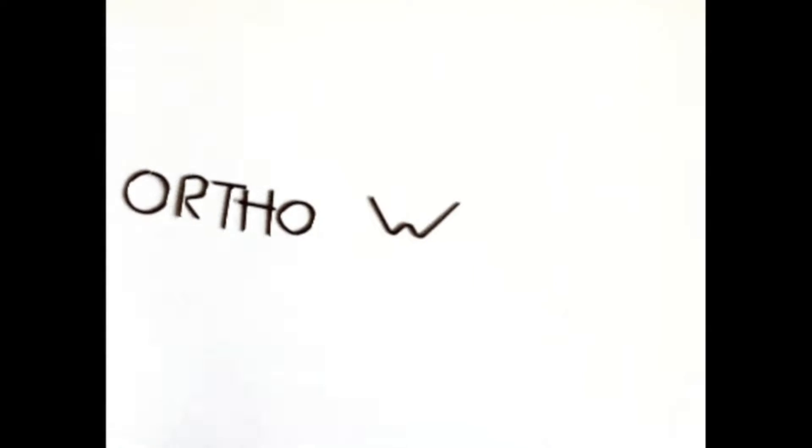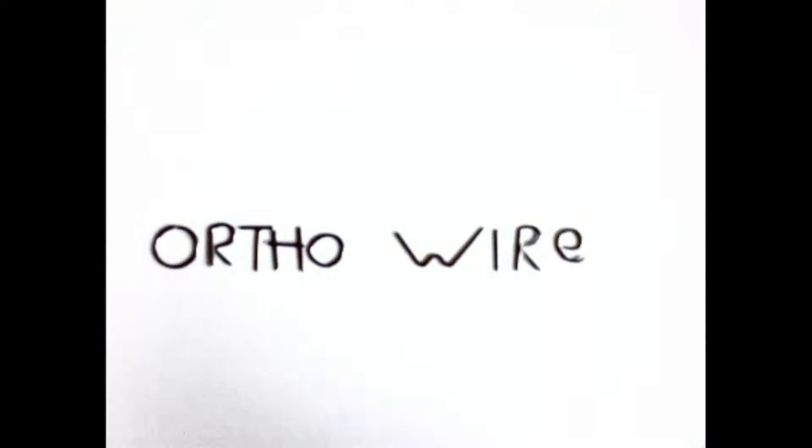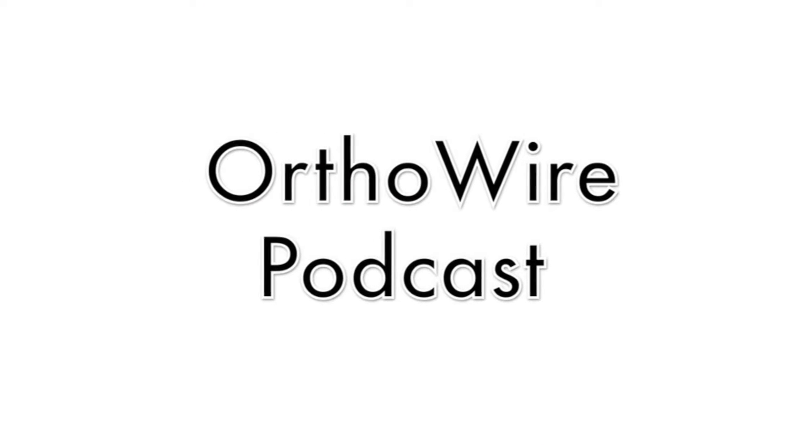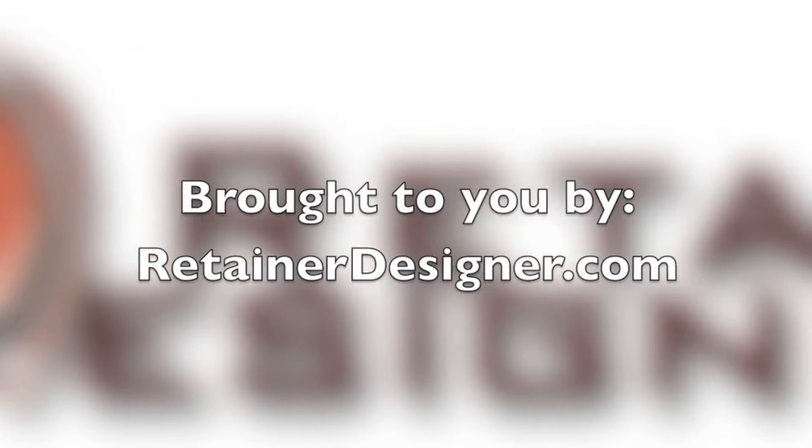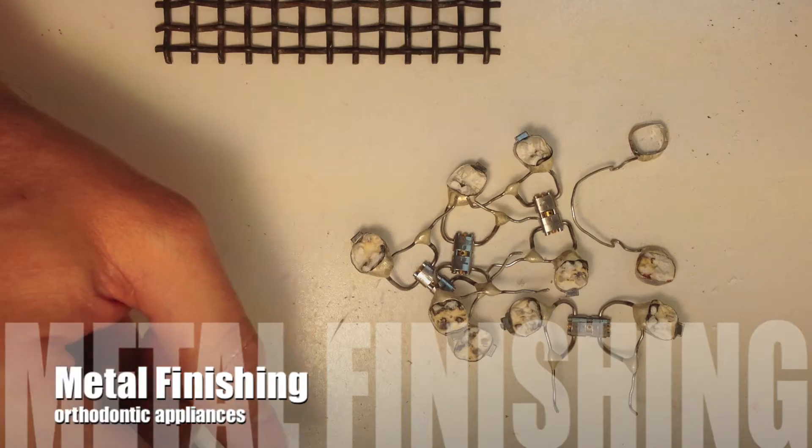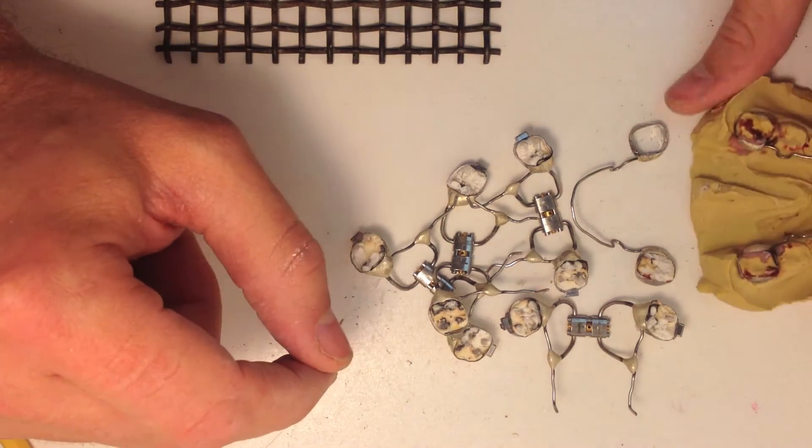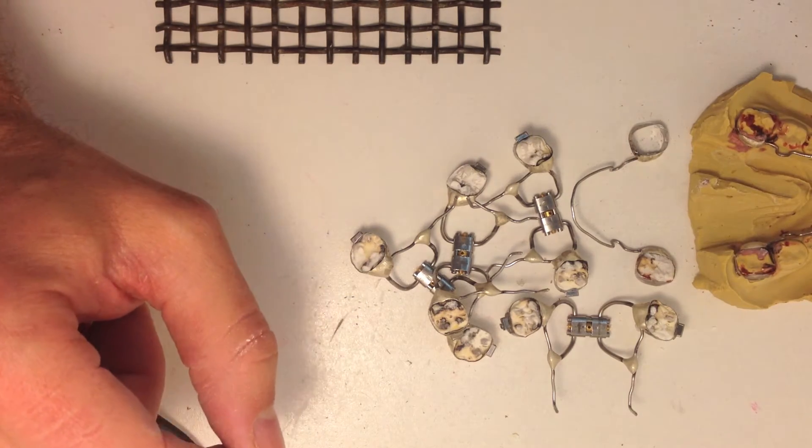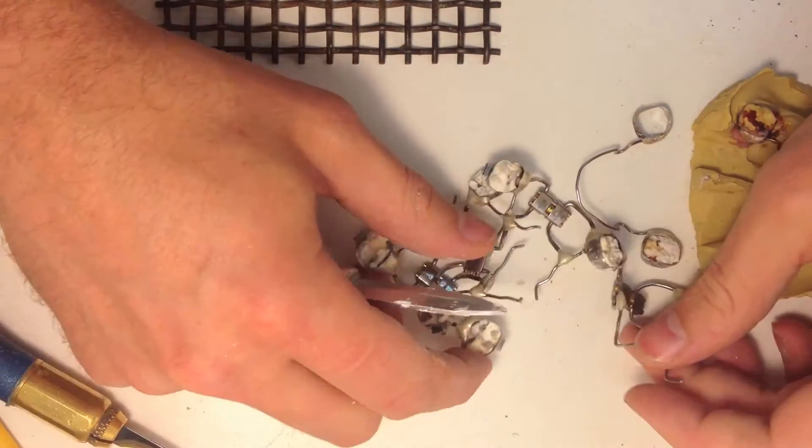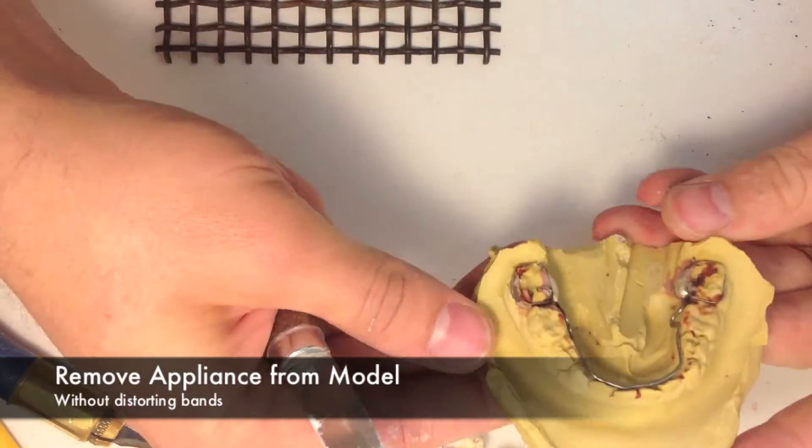Let's get started. There's a question on YouTube on how to finish some of these metal appliances, so I'm going to do a few of these here, just kind of show you what I do. First off, this is how to take them off the model. This is how they come to the acrylic guy who also does the metal work.